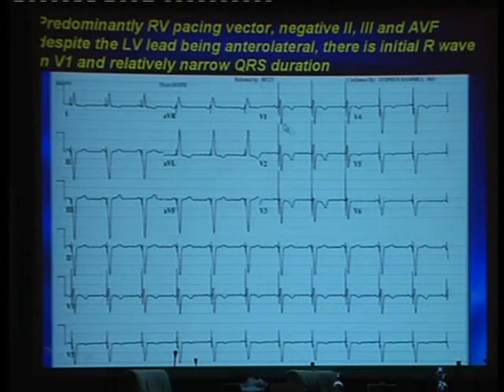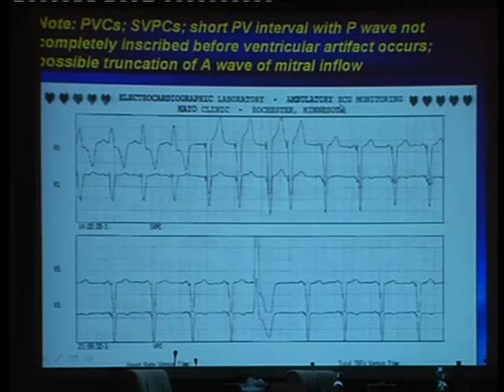If, by contrast, you really do the approaches during ventricular pacing, it's a very relaxed procedure that you can take lots of time to identify potentially areas of interest and then take them out of the equation. And when you're done, you go back in and again repeat an induction to see whether you removed it. And with that kind of approach, these are our results, that we have 75% success acutely after one procedure. And the encouraging thing is, of the ones that are refractory, if you go back in for a second time, about half of those people will become responders, and the ones that you still have to go in for a third time, you can recruit some of those, at least convert them to be responders.